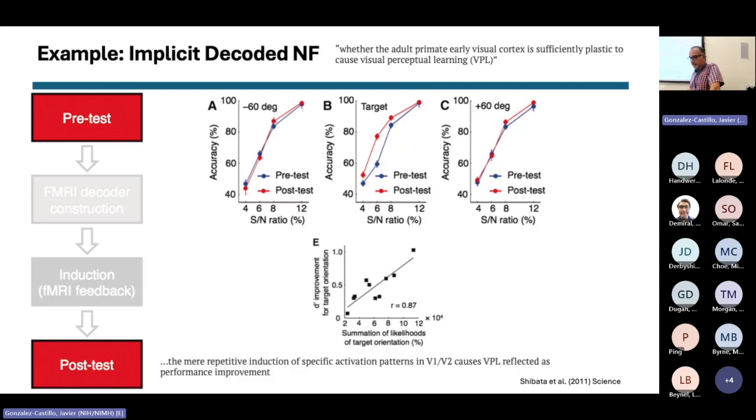So I really like this study because I think it's a good proof of concept and also a good example of how you need to design one of those experiments by having different conditions with different noise levels, a lot of the aspects that you should think about when doing neurofeedback. Was this clear?